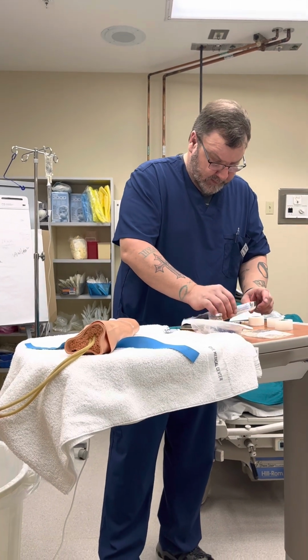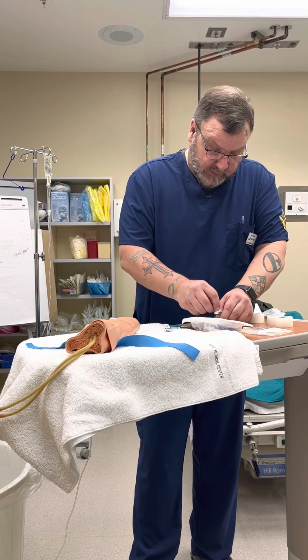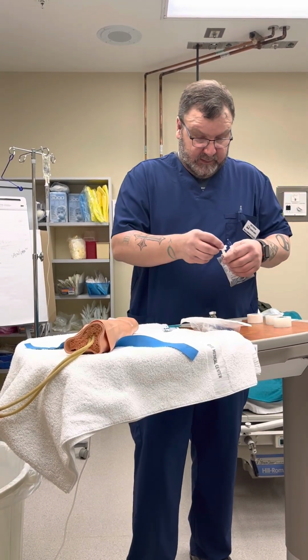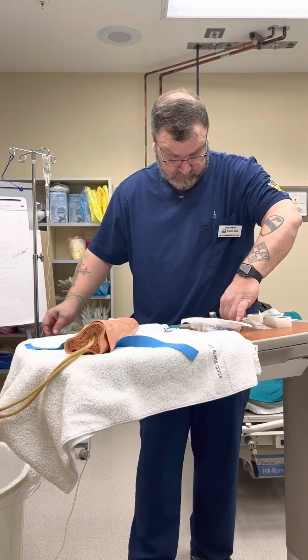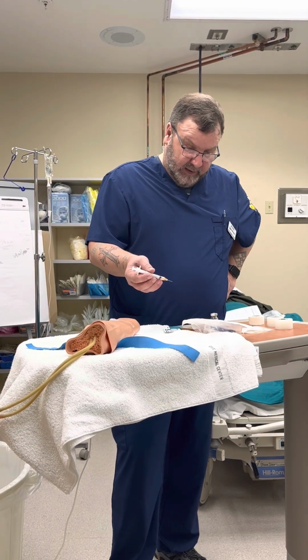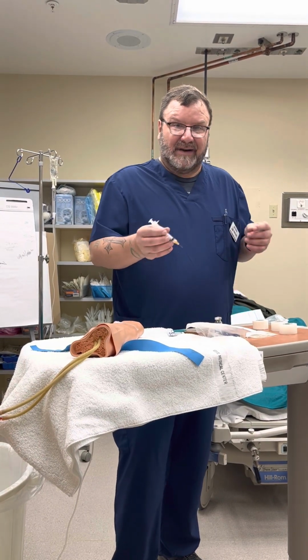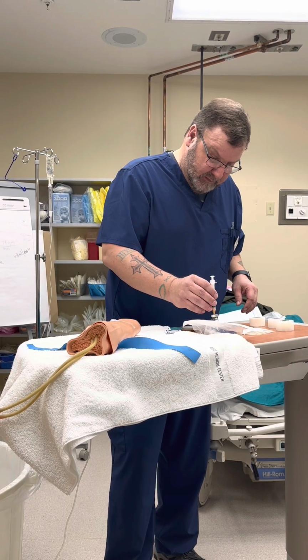Okay, so I have my syringe ready. I'm going to clean the top of this vial. I've already cleaned this. Probably wouldn't hurt to do it again. And I know I am taking 1.2 milliliters of this medication, and that's based off of the calculations that we're submitting with this, the dosage calc that we've done.